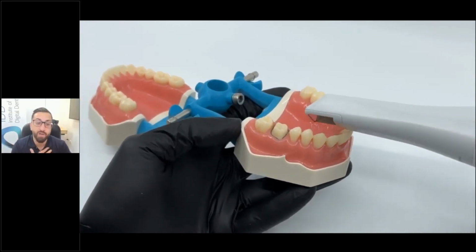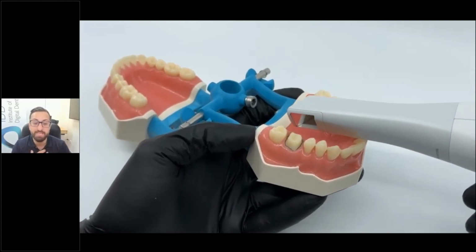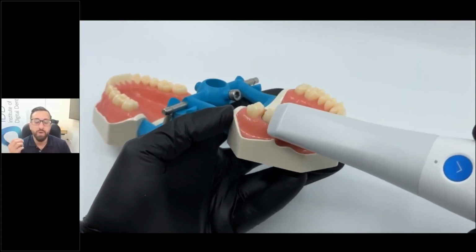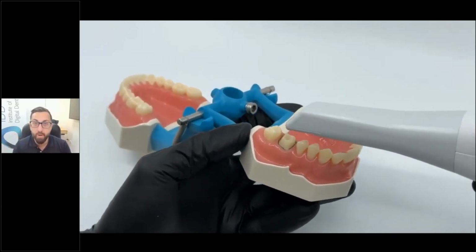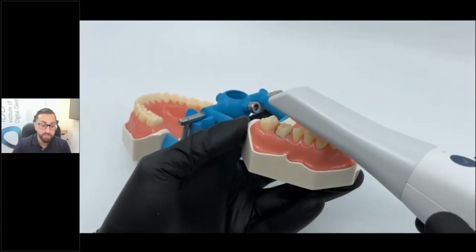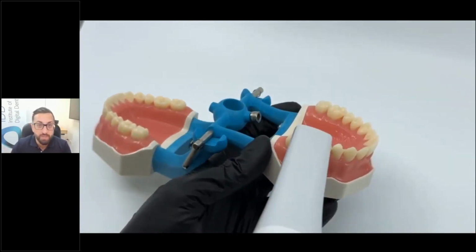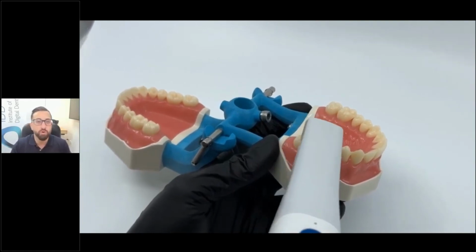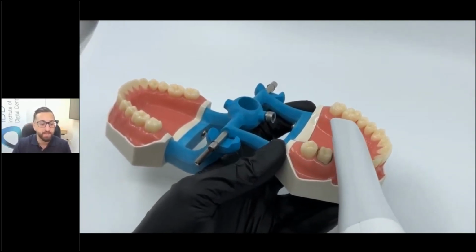I personally use a lot of quadrant scanning in my same-day dentistry, but I am designing and milling the crowns, so I would recommend you discuss with your lab what they would prefer. Without a doubt, quadrant scanning does work, especially for a single unit. Anything beyond 3 to 4 units or a bridge, I would be taking a full arch scan regardless.